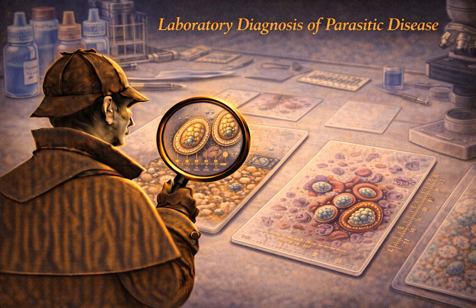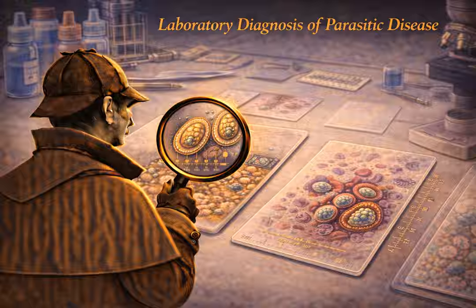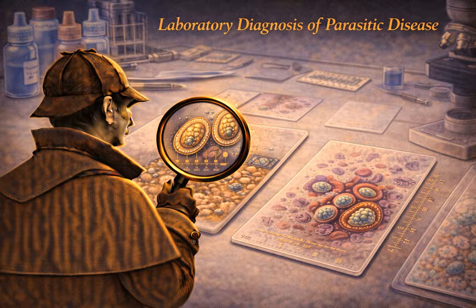Okay, let's completely leave the GI tract now. We are moving into the bloodstream. Section 5. The malaria protocol. This is arguably the most high-stakes life-or-death section of the entire chapter. Malaria is a true medical emergency. Plasmodium falciparum can easily kill a healthy, non-immune adult patient within a matter of days if missed. Murray heavily emphasizes that hospital labs must offer 24/7 testing for this. You cannot just leave the sample on the bench and wait for the morning shift parasitologist to clock in.